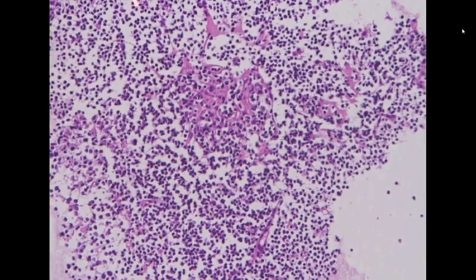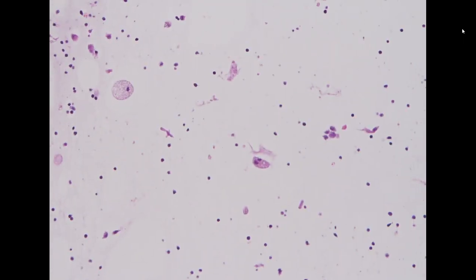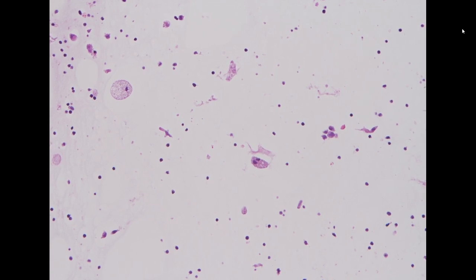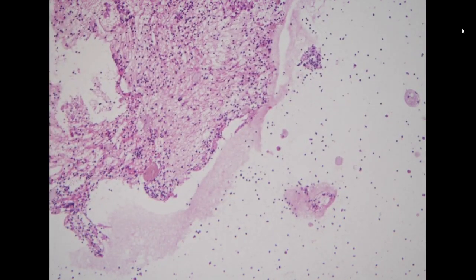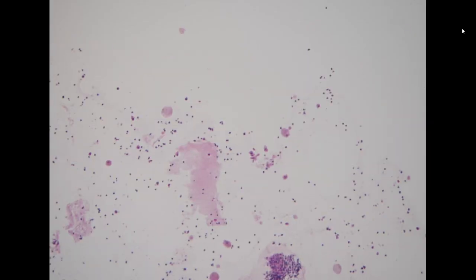But we still didn't see any oncocytic cells, so we have to call this specimen non-diagnostic. I think it's kind of tricky, because either way it's negative for malignancy, right? It can be a benign tumor or it can be just a cyst. It's a little bit strange to call it non-diagnostic. But the way we call it non-diagnostic is that we want to diagnose it as Warthin tumor, but this is non-diagnostic, so we still make a note.